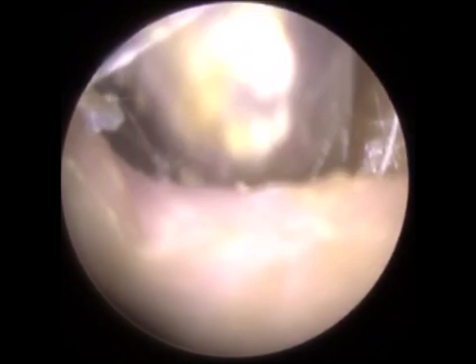So using the suction probe to bring this a bit forwards, get a leading edge, a tail, and I'll probably go in with some forceps just to grip on that, because the top part of this is a bit firmer. You can see that the base of this keratin plug is wet, but the top part is a bit crustier. So if I can get a grip onto that, which I'm not sure if I managed to. No, it's just slicing there. But I will persevere. Oh yeah, no, I managed to get a big piece there. Another piece of keratin.